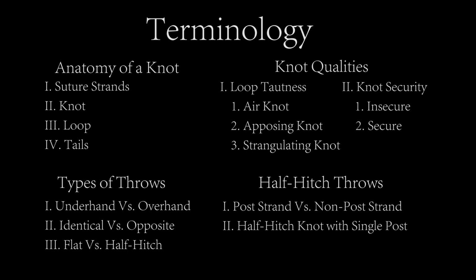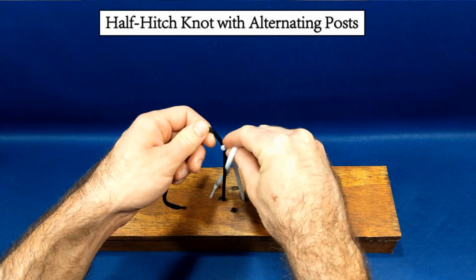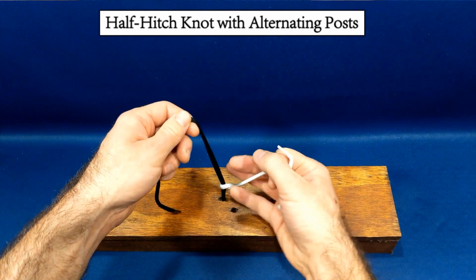In contrast, a half-hitch knot with alternating posts results when two throws are tightened using different strands for the posts. For example, here an overhand throw is performed and tightened using the black strand held by the left hand as a post.